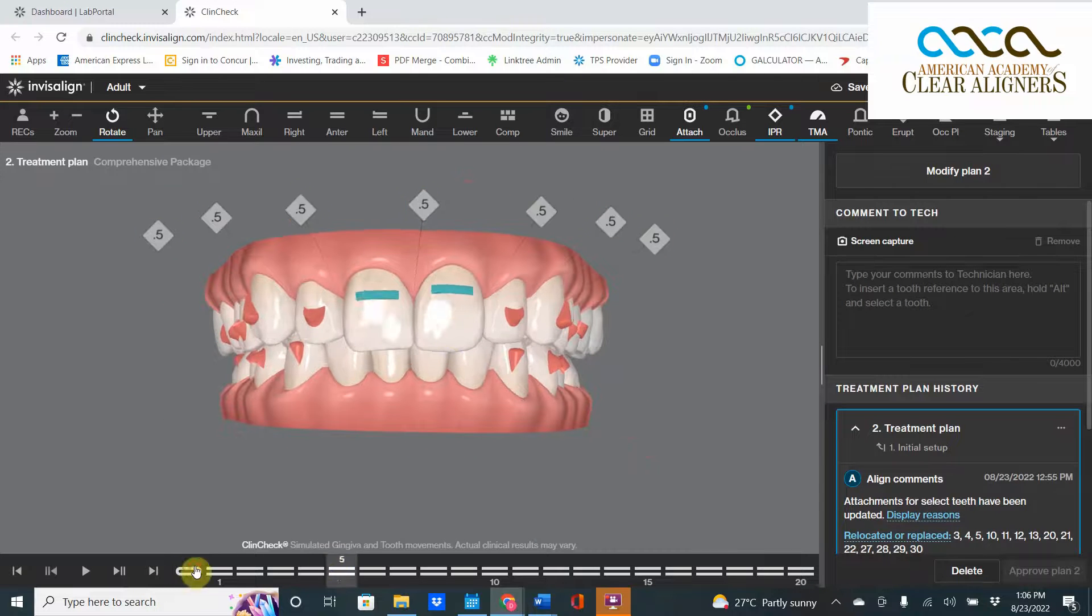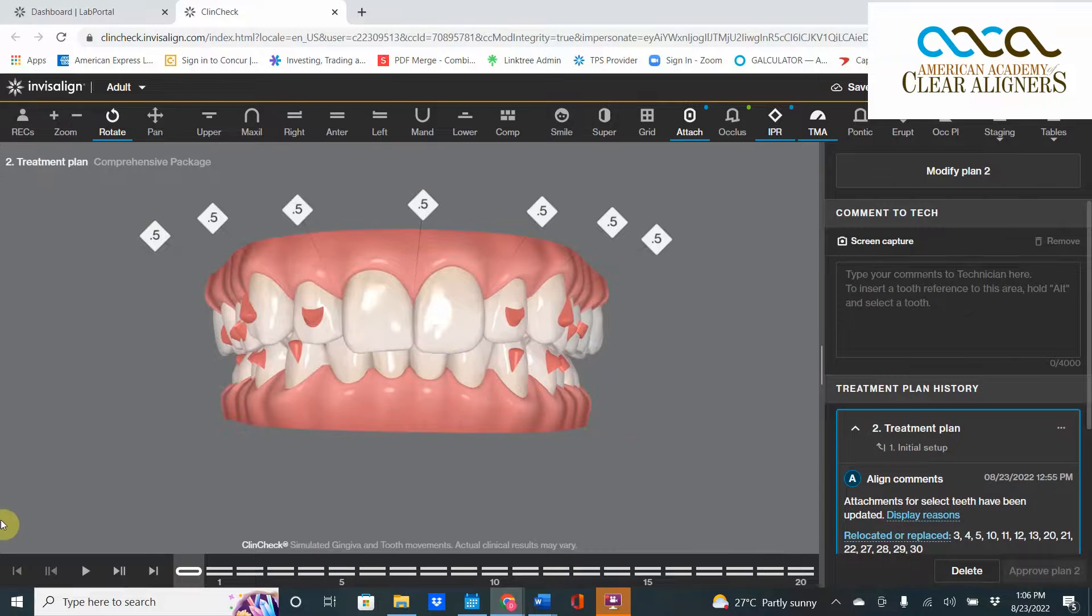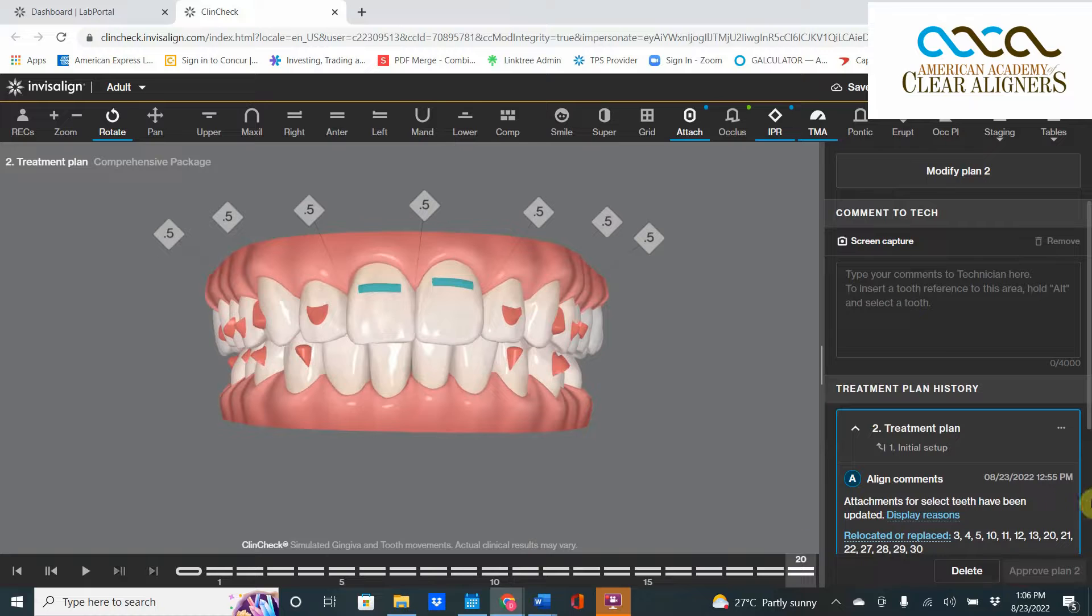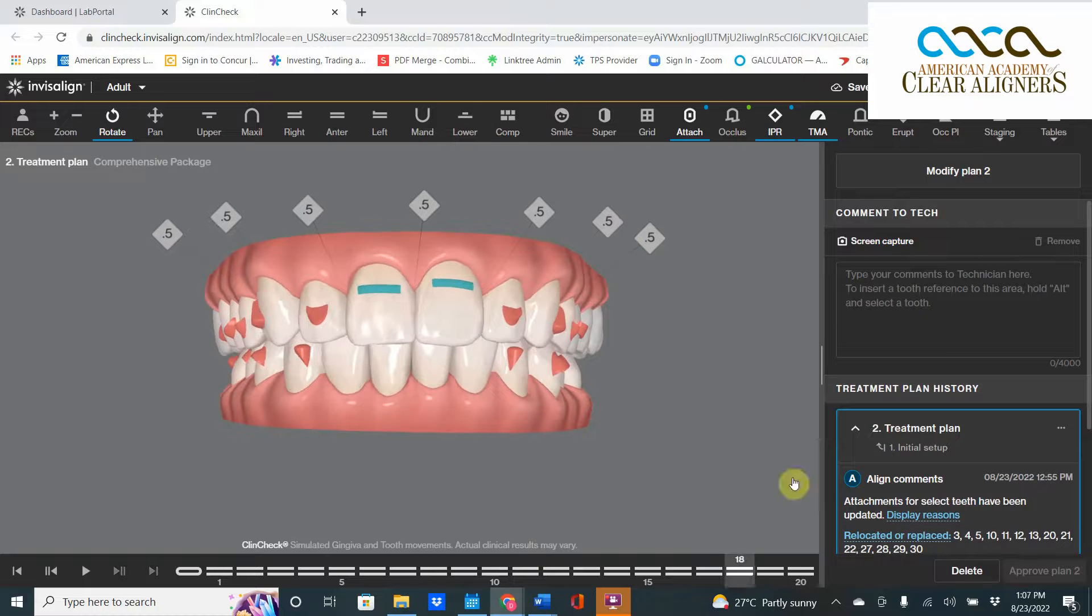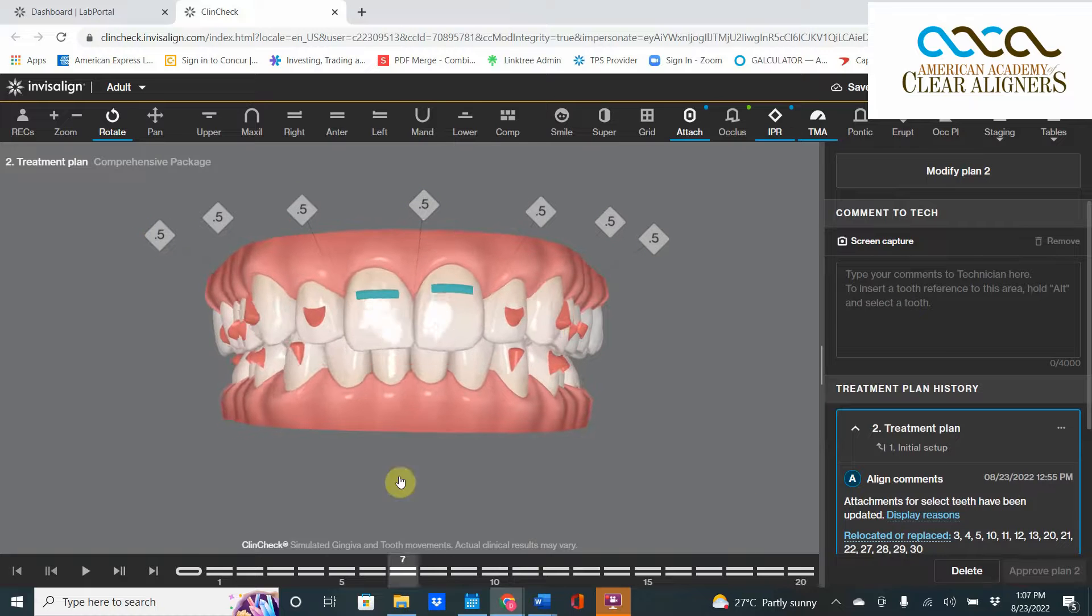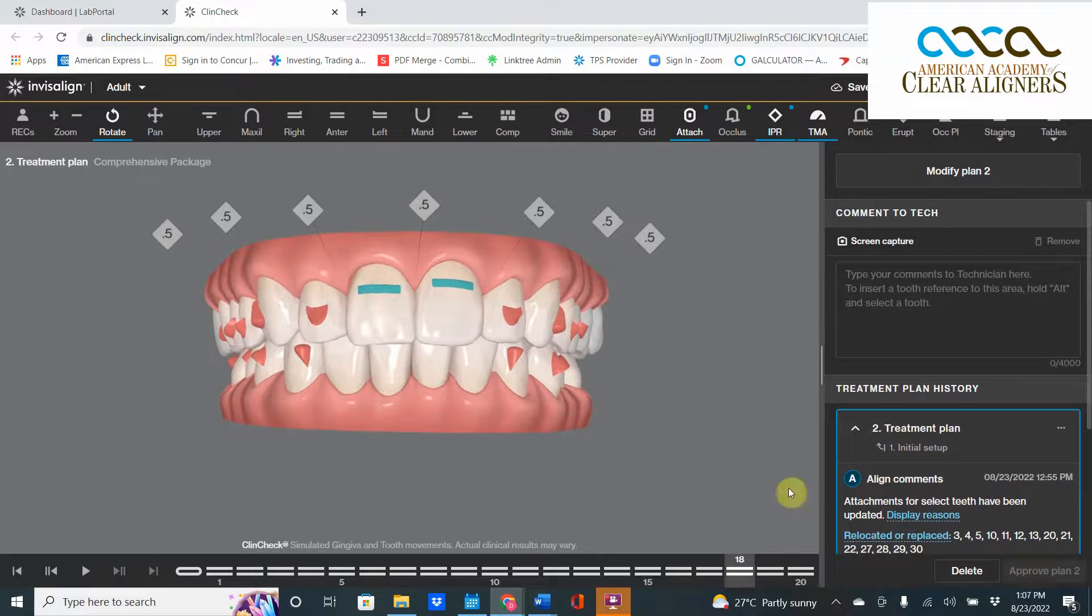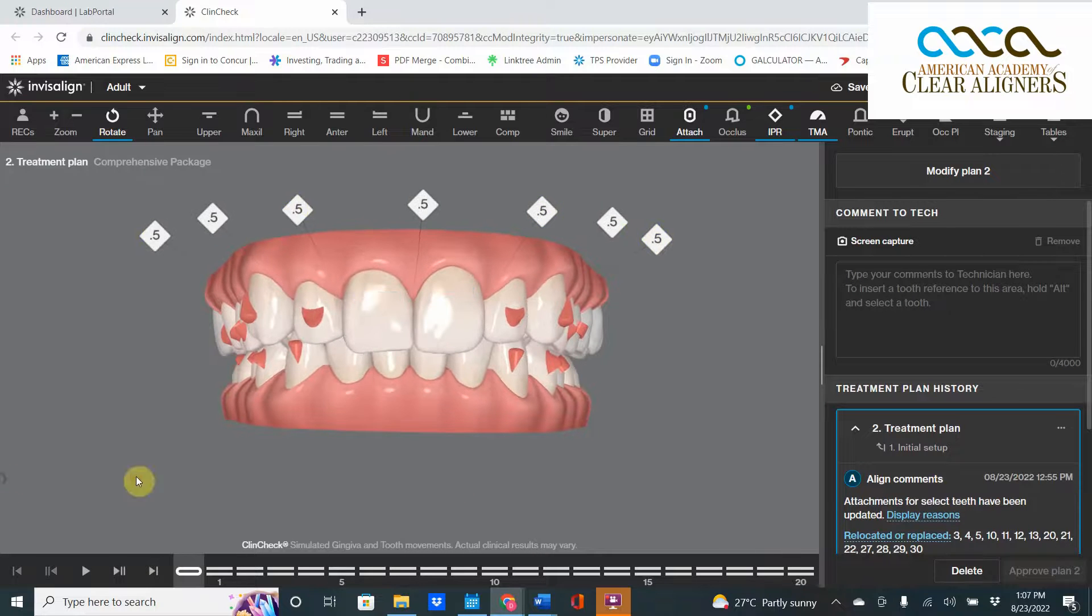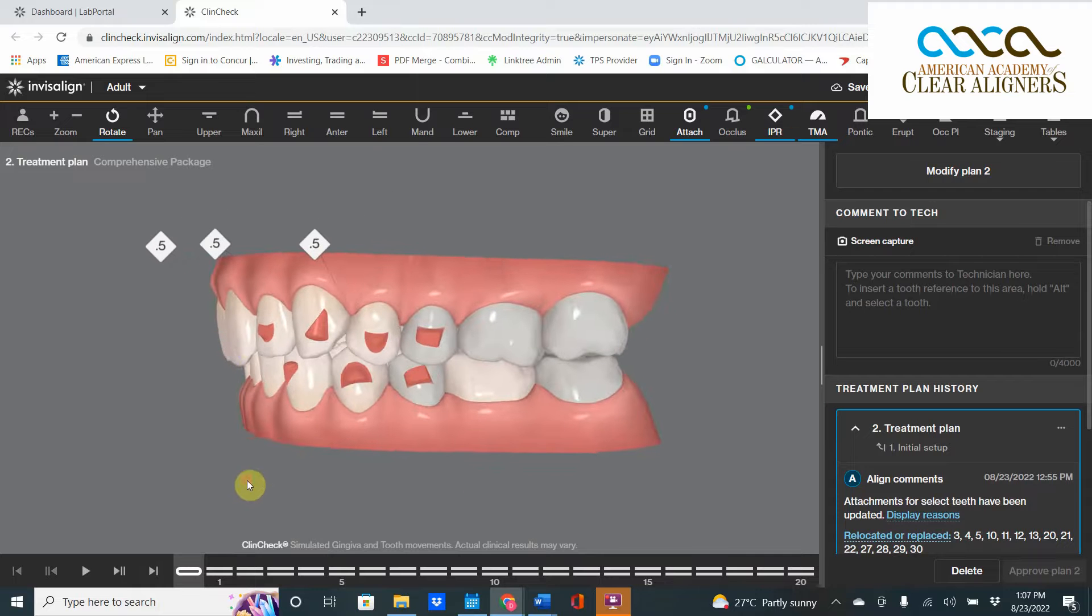We play the ClinCheck and it looks pretty good. There's some expansion, we've got expansion of a molar, some intrusion, the canines are rotating out. Most doctors would hit accept, but I want to train your eyes to watch those central incisors.